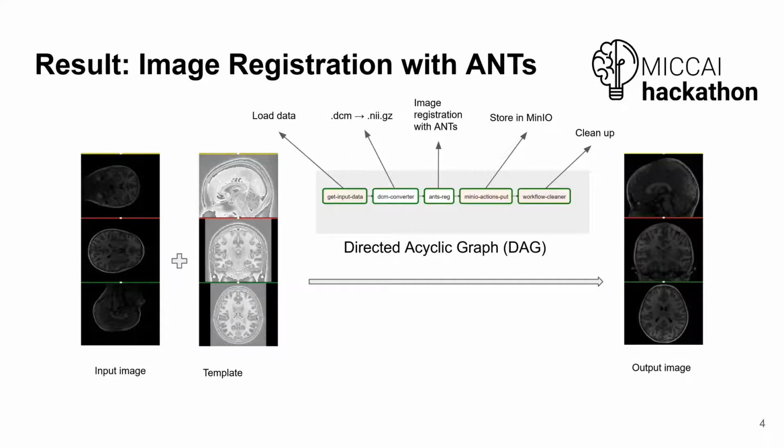And the main thing is that the Kaapana flow is based on Airflow. So you always have to create a Docker image and wrap this Docker image into another operator, Kaapana operator, and then you get what you see on the slide, those directed acyclic graphs, which basically represent the processing pipeline, first loading the data, then converting maybe the data type, and then performing the image registration in this case.